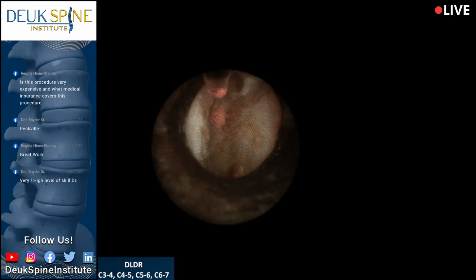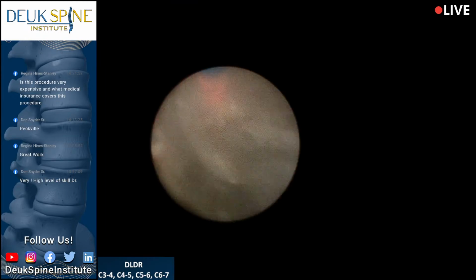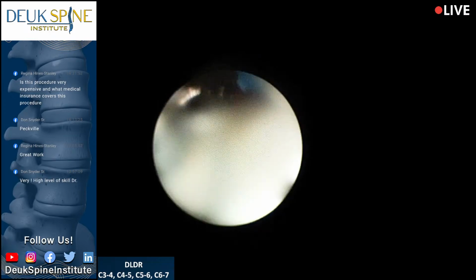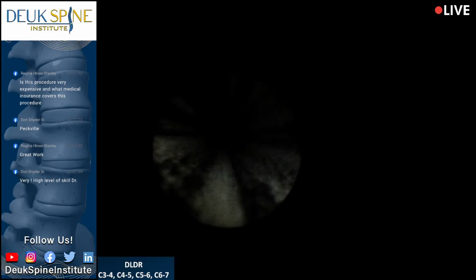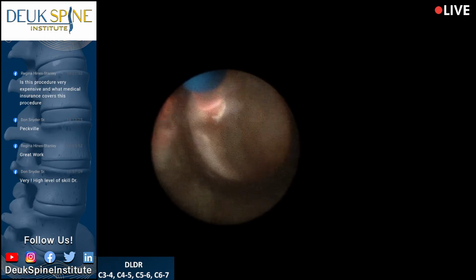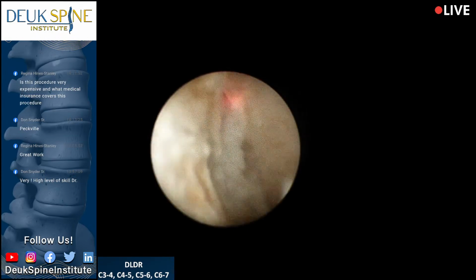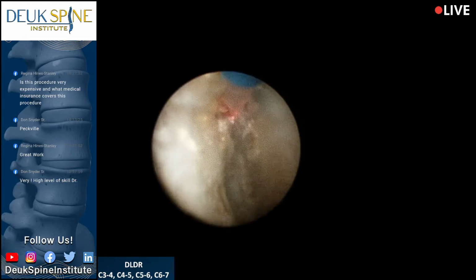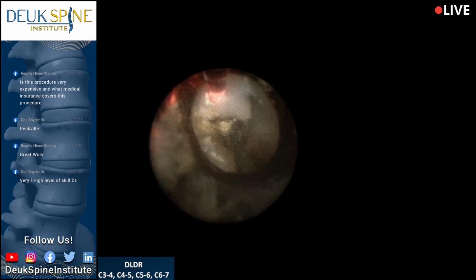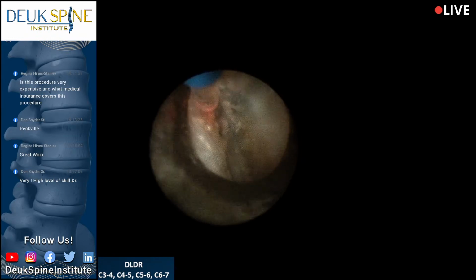Is your guy over there? He had to leave for his flight. So you're on your own. Are you okay with that? I don't know why they brought a 9-inch II. I was like, come on. We don't use 9-inch IIs. We use 12 inches. Well, he probably said, what do you guys do? Pain management? Oh, we have 9-inch. But we do spine surgery too. So you need a 12-inch II for spine surgery on a fluoro. Anyway, we'll get another week of demoing with them out of it. Is that way better than the old one? A lot of the programs are a lot better to use, easier to use.